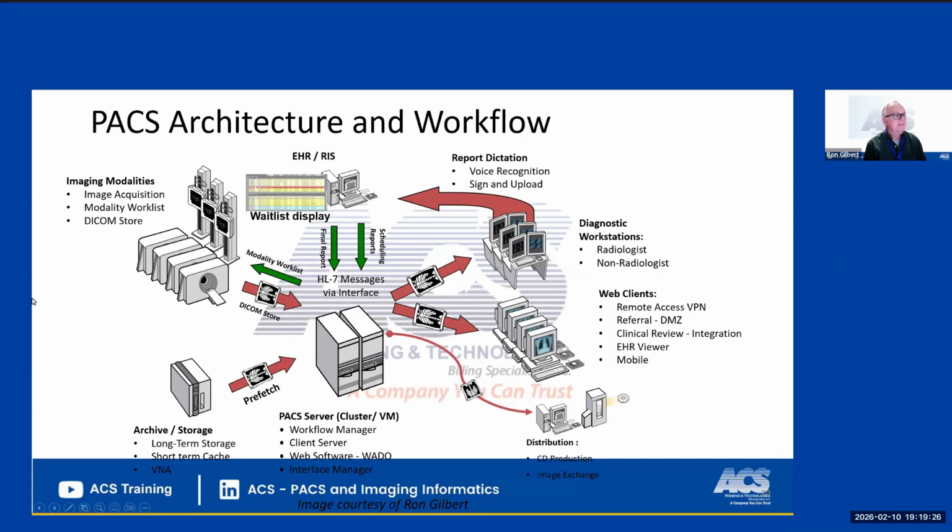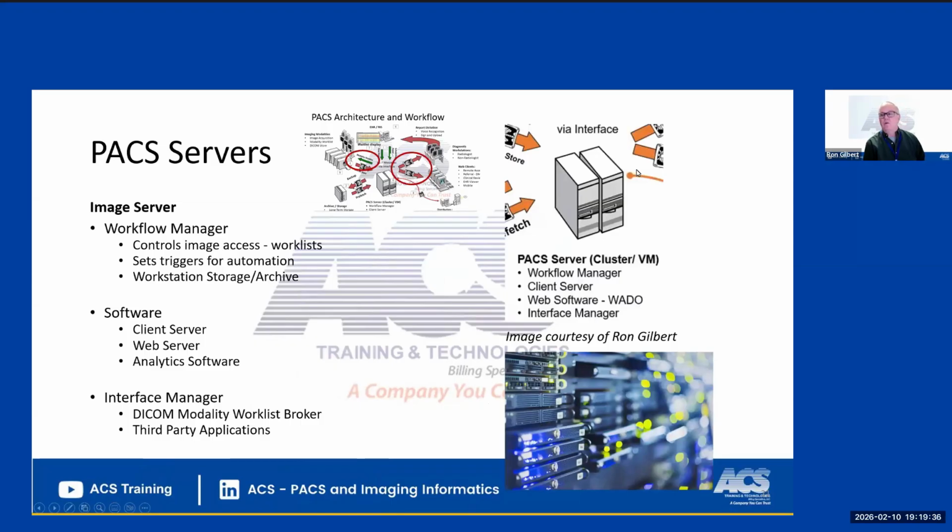So that really is kind of how it all works, and we will go over that in greater detail. And then you back up the system and you have it ready for the next time you need it. Now we'll go into the different parts. What do the servers do? What are they made up of? How you build a server. I'm not saying you have to build it. You just have to know what to ask for.